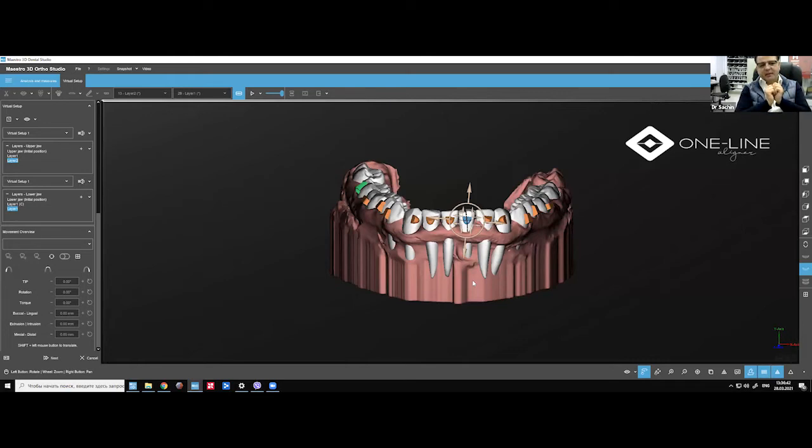So Invisalign, for example, has come up with a G8 smart force that they have compensated that the force will be equal on all the 6 teeth. But actually on our software, when we use it, we should know that it might be that the canines and the lateral incisors intrude a little more than the central incisors because of the reason that the force gets less as we move farther from the teeth which are holding the aligner. I think that will be clear for everybody. But the attachments here will help us to keep at least relatively equal forces on all the teeth, right?